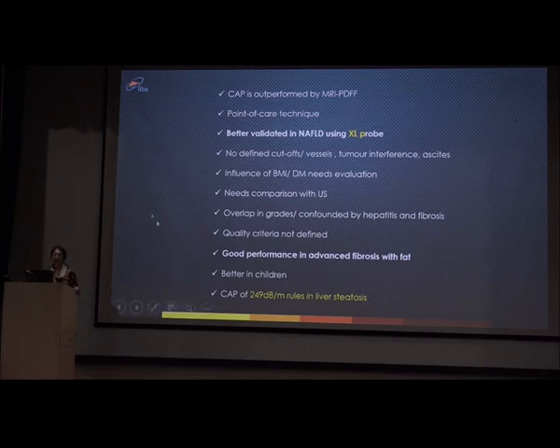So the quality criteria for CAP is not defined, although it has been shown to have good performance in advanced fibrosis. So wherever a patient has advanced fibrosis and fat is occurring with it, there you may still rely on it, but anything beyond or less than that, it is not a very reliable indicator. It is of course a very good indicator in children because the abdominal wall is small and you don't have that level of fibrosis so soon.